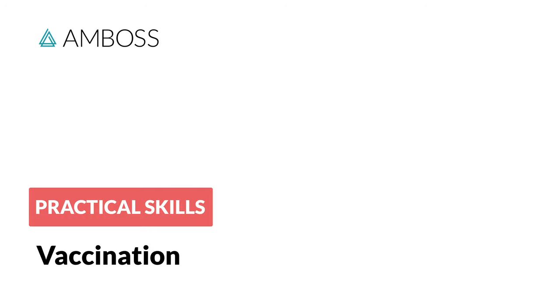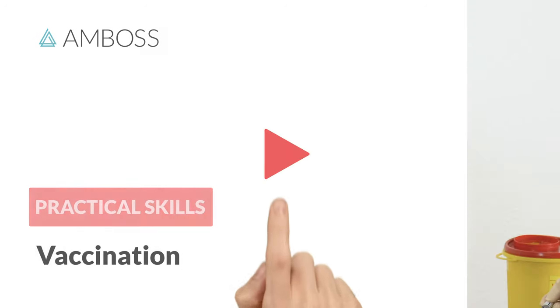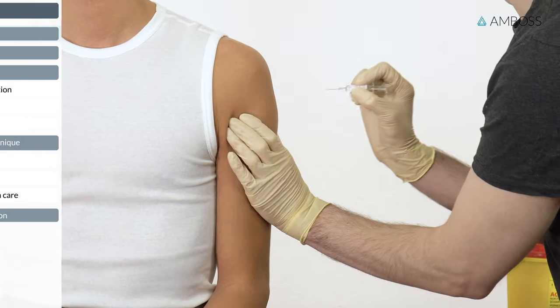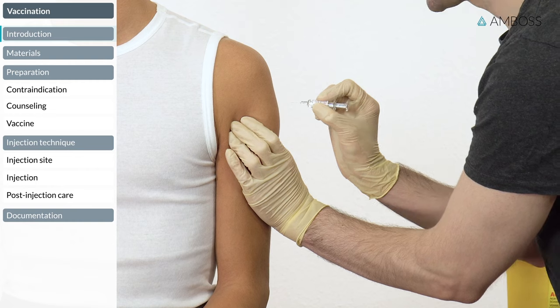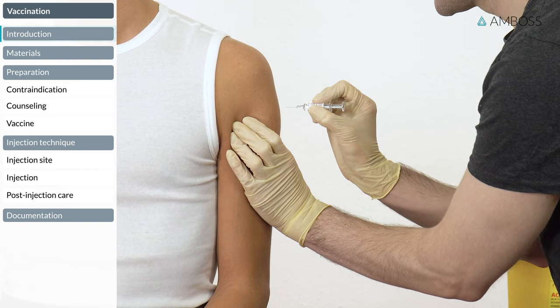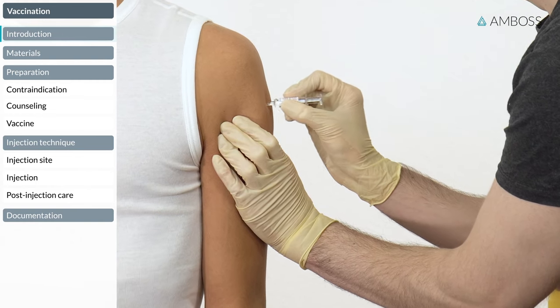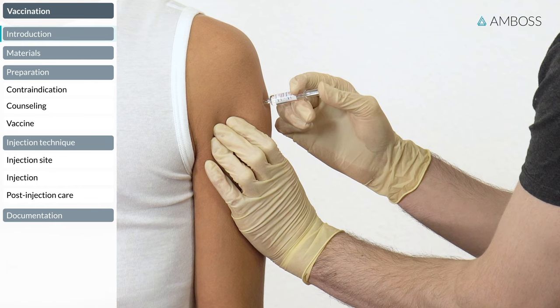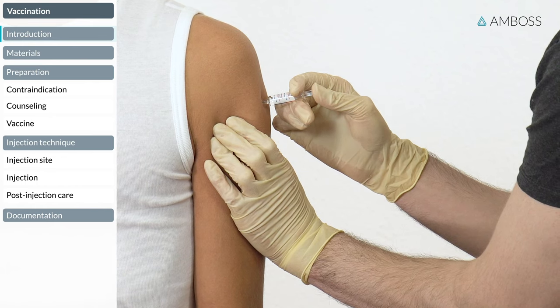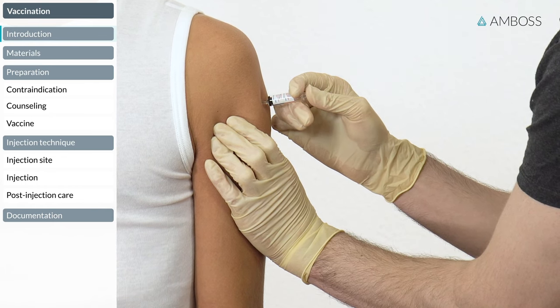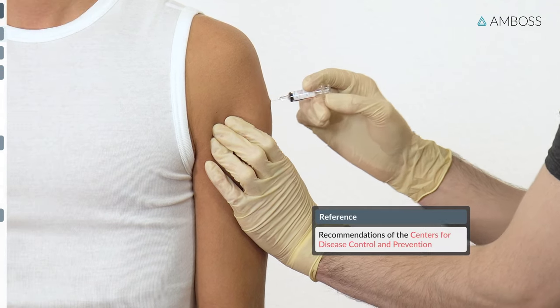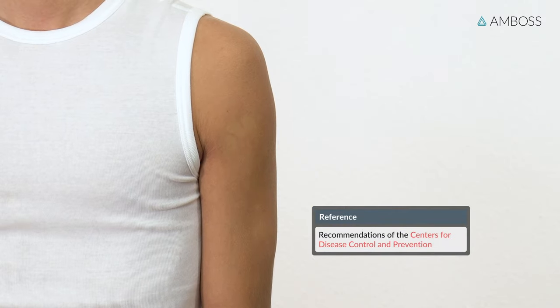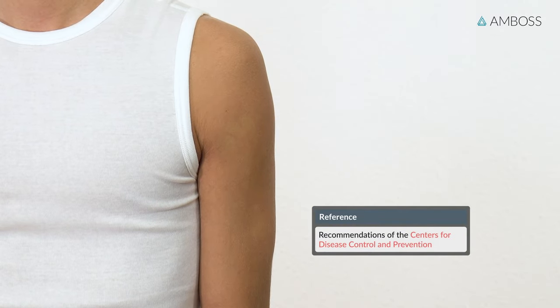Welcome to the AMBOSS tutorial on administering vaccines. In this video, we'll be using the standard vaccination technique, which is intramuscular injection into the deltoid muscle. This technique is used when injecting almost all vaccines from childhood onward. We'll be referring to the recommendations of the Centers for Disease Control and Prevention.